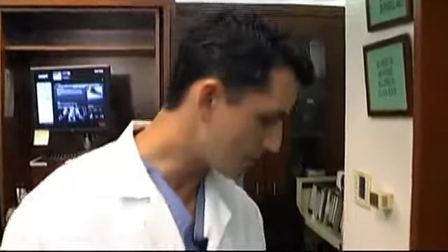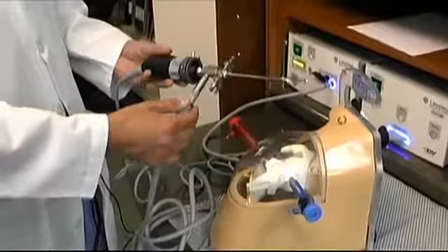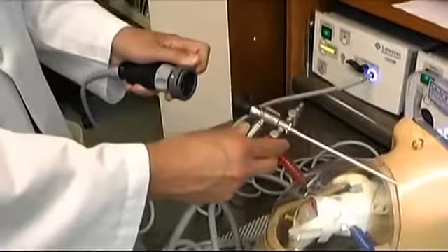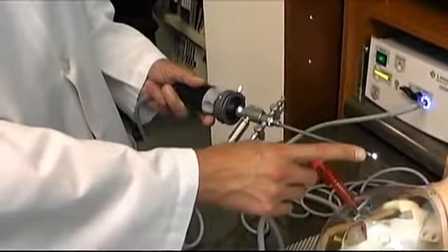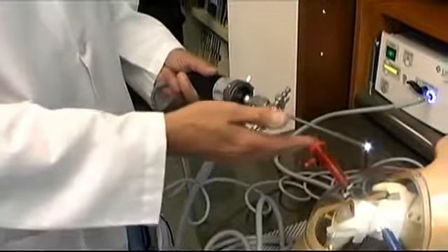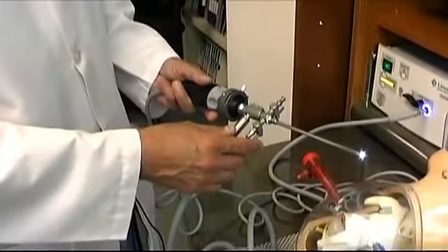surgical techniques. Now, I'll start with a little bit about arthroscopy itself. Arthroscopy begins with this here, which is an arthroscope. It's a 3-chip high-definition camera attached to a scope. The scope itself can then be placed inside the body through the tiniest of poke holes and illuminate different joints within the body. In our practice, we use scopes on shoulders, knees, and hips.